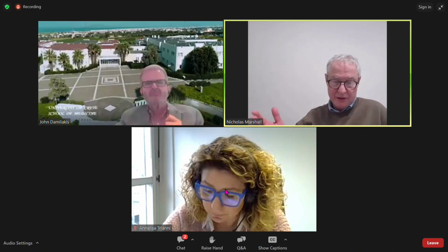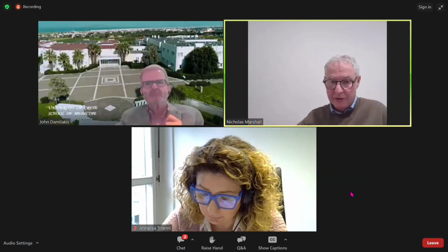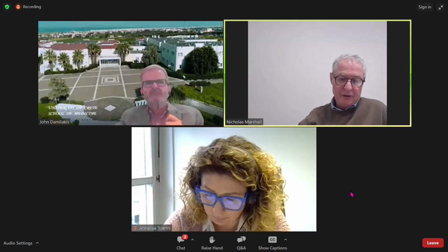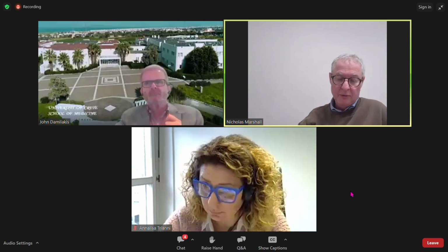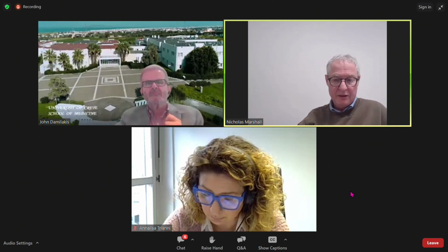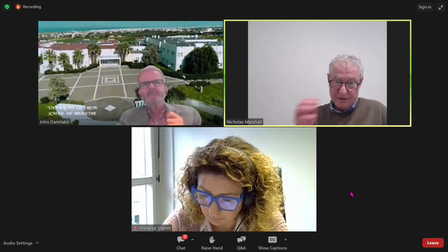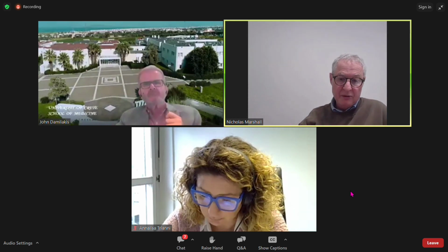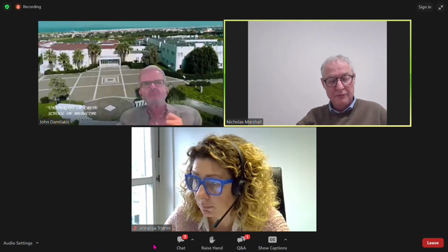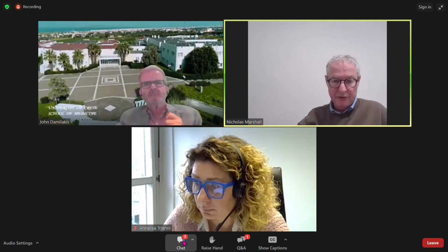And therefore, if you can do those, you'll probably have too much image quality for the easy ones. You could have used an easier setting or lower doses for the easier tasks. But it's kind of statistical. You need a general setting that works for most of the tasks that you want to do on the imaging system.